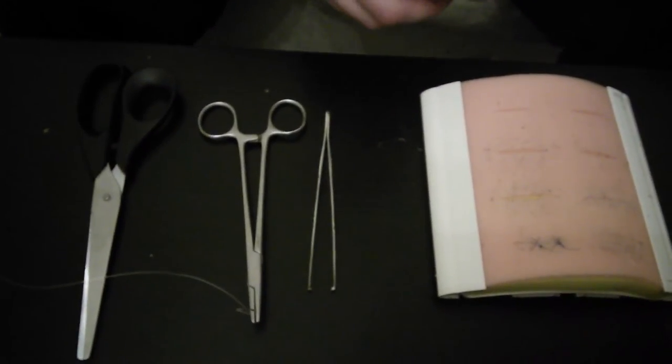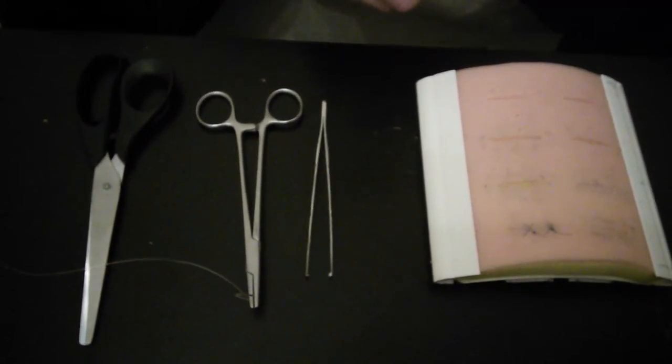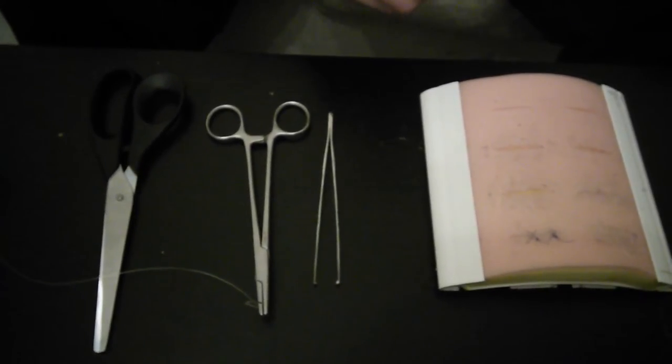Today I will be showing you how to do a Lambert suture. This is an inverting suture used in areas such as the uterus.